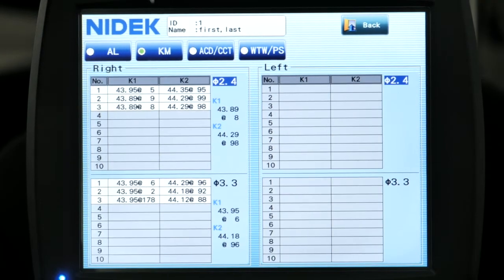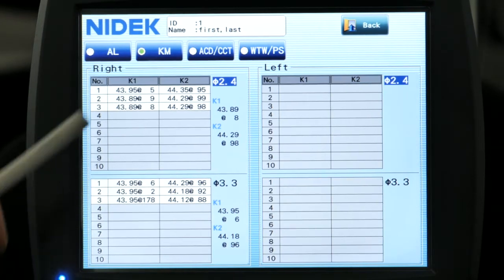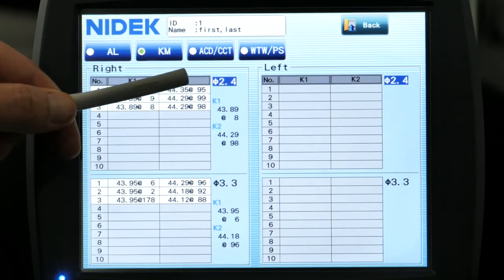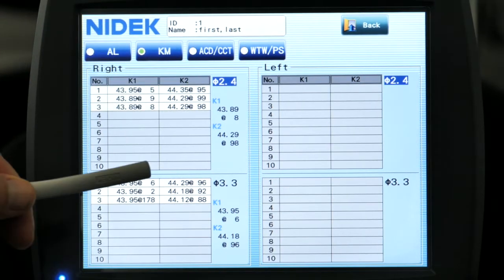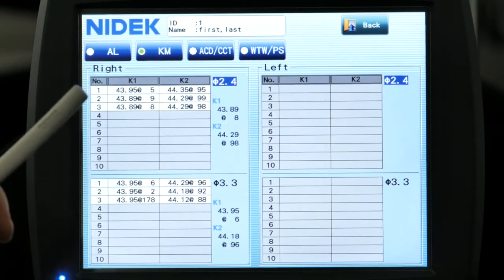You can look at your keratometric measurements. As you can see here, we have the 2.4 and the 3.3 Mayer rings. So we have two Mayer rings. Each Mayer ring has 360 data points, so you're getting a total of 720 data points.